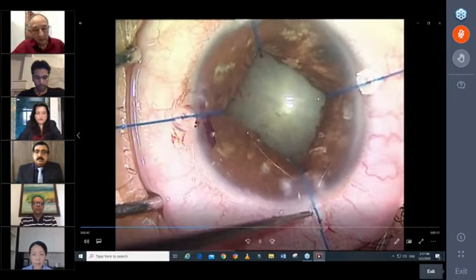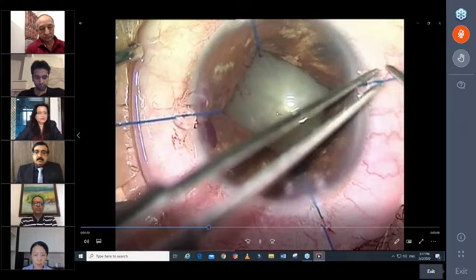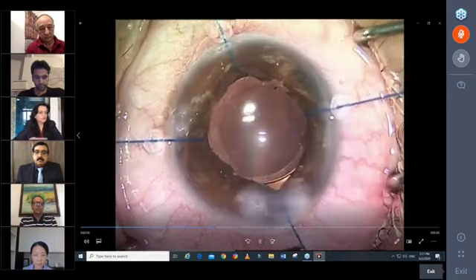And you can see we slowly titrate the size, we can adjust the size, and that's the good thing about iris hooks, because you don't have to stretch it all the way out. You may not need such a big incision. As you saw, Rohit also mentioned that micro incision, which I used here so that the iris wouldn't give me trouble when I start to manipulate. This is the end. You can see a nice round pupil.